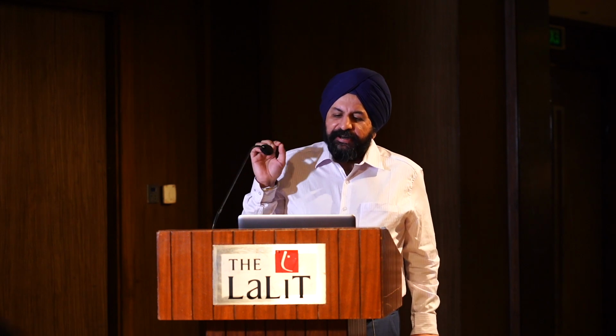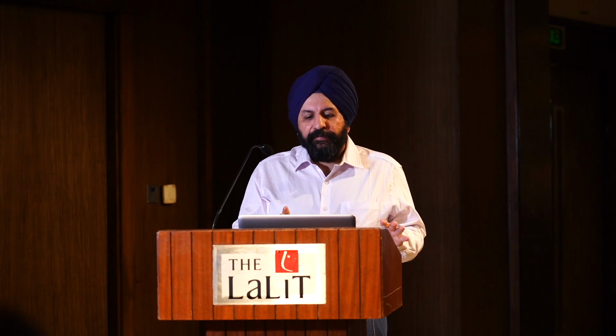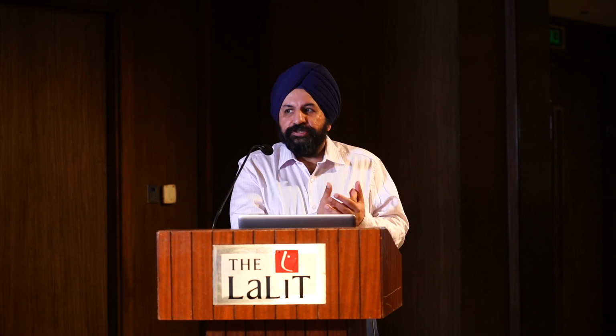So PHR trough and PHR fall were the best predictors of platelet recovery. What we did was, we combined both platelets as well as HFC, and we did their ratios. They were the best predictors of platelet recovery amongst the parameters. So platelet HFC ratio was the best parameter amongst all the parameters, IPF, HFC, PLR, NLR, MPV put together. So with these words, I'd like to thank you all, and we'll take questions in the end.